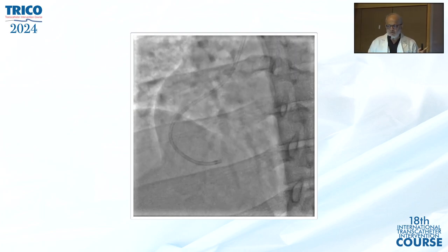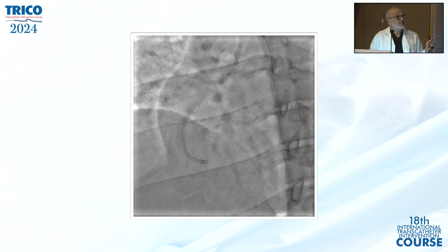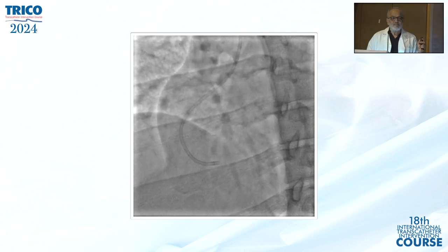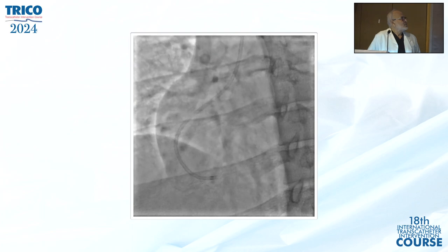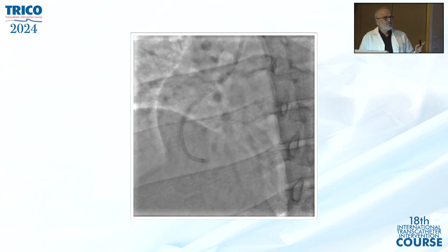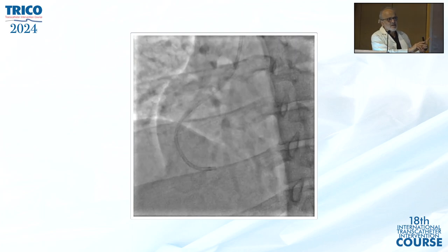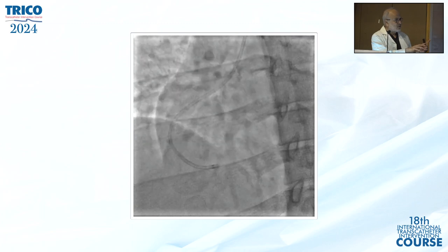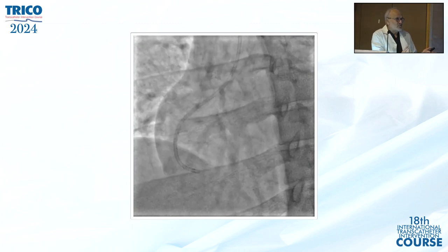Nothing used to come out, and meanwhile probably the whole guide catheter was completely filled with thrombus. That is what was the contemplation by me as well as Sanjay both. Tejas, is this 6 or 7 French? This is 6 French. Now, I had no choice, otherwise I will never allow this guide to come out of the right coronary ostium. I know it can embolize. But here I had no choice because I was completely clueless what to do.